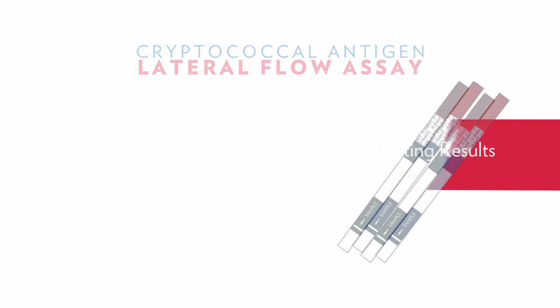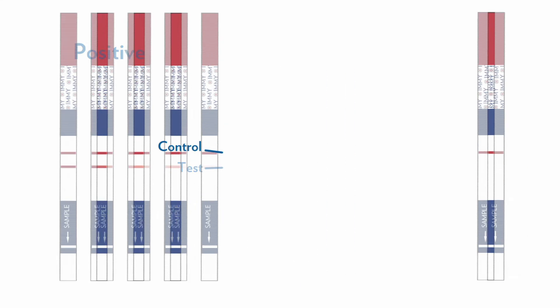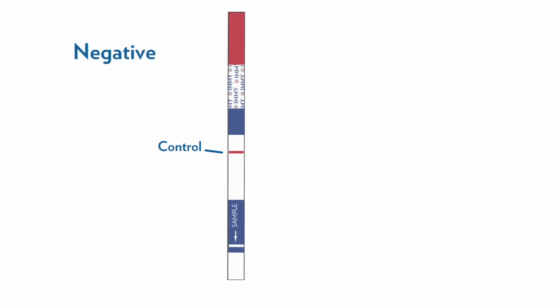The presence of the control line and the test line, regardless of intensity, indicates a positive result. The presence of a single control line indicates a negative result. If the control line does not appear, the result is invalid and the test should be repeated.